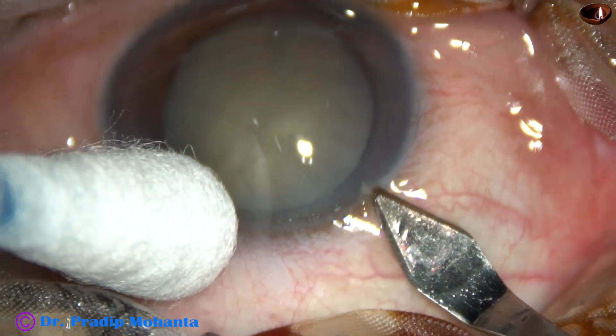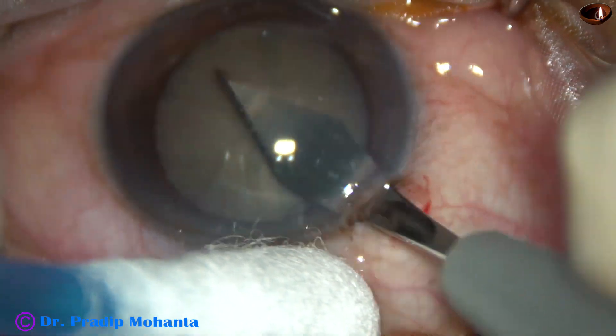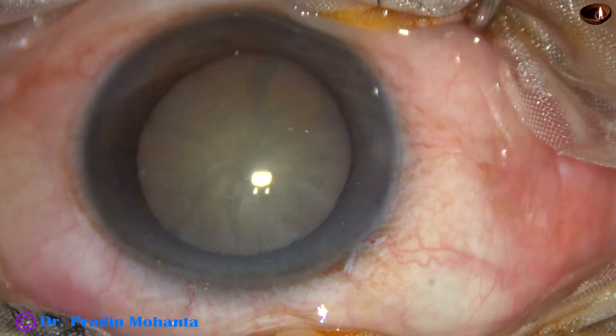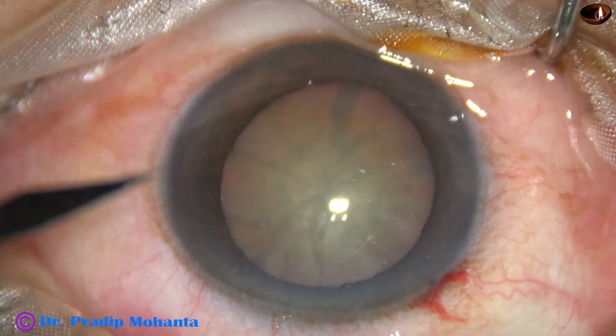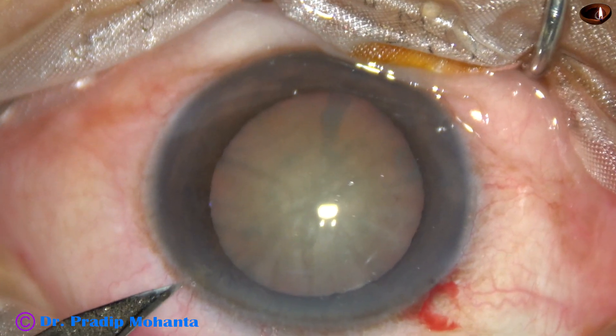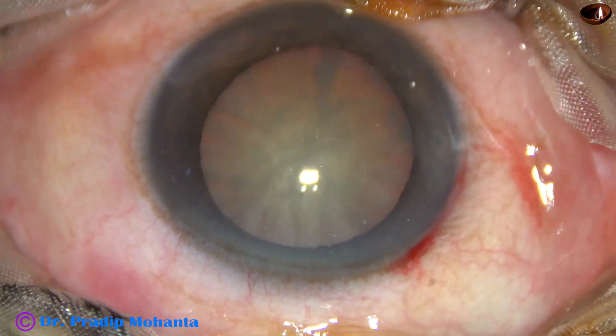This is the main incision with a 2.8 mm steel keratome. One side port is being made on the left side of the main incision, about 3 o'clock hours away.